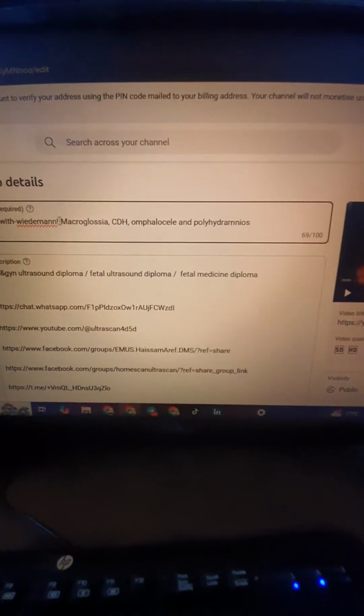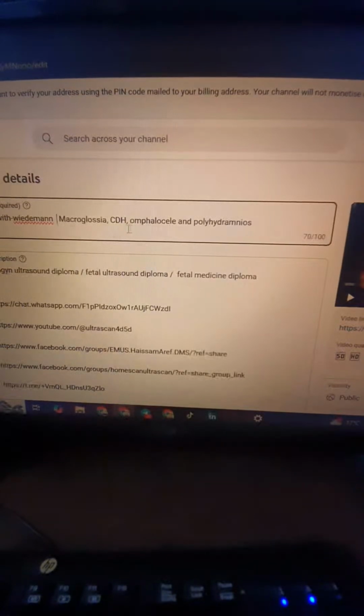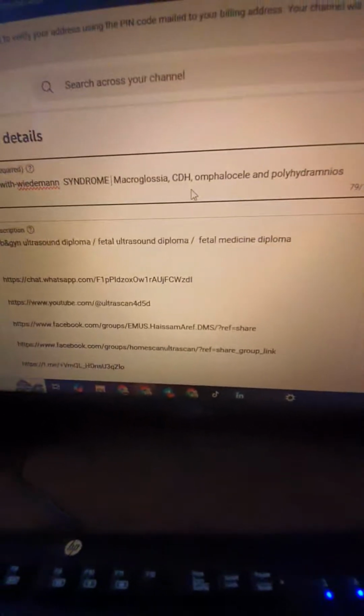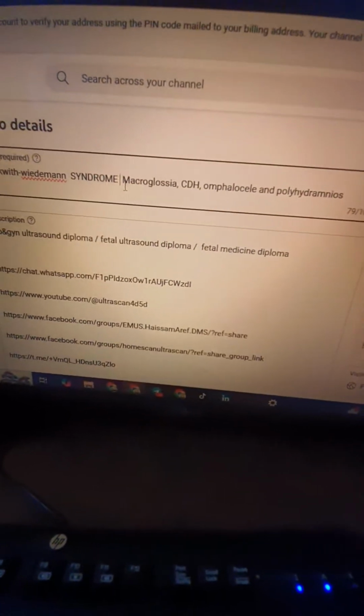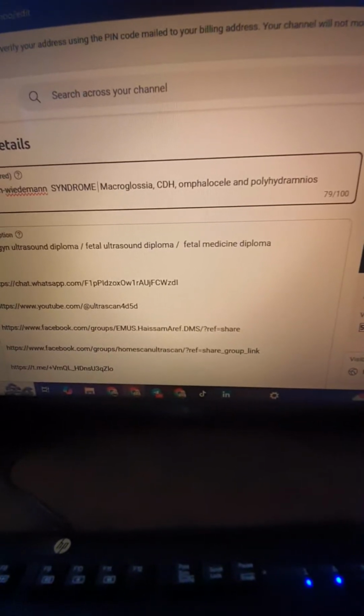Beckwith-Wiedemann syndrome, yes. Macroglossia, congenital diaphragmatic hernia, omphalocele, and polyhydramnios. Beckwith-Wiedemann syndrome. And you can go and check out our website for an illustration about Beckwith-Wiedemann syndrome. This is our weekly ultrasound post, my friends.